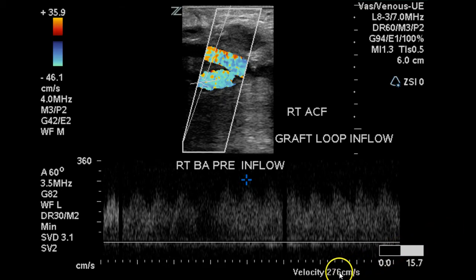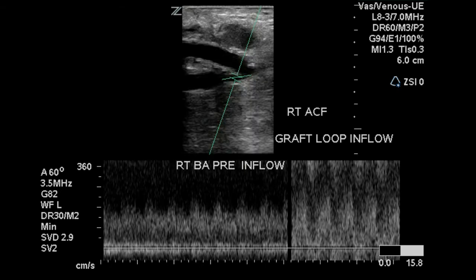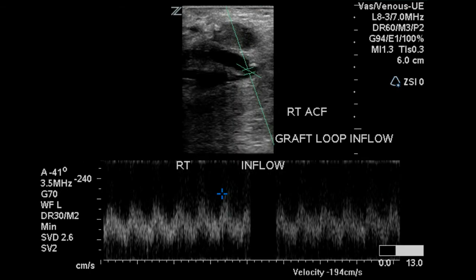We can see that the velocity here is 276 centimeters per second, and we should expect to find a similar flow pattern and velocity throughout the graft. Here, closer to the anastomosis, we again see the turbulent, low-resistance flow, and at the anastomosis as well.